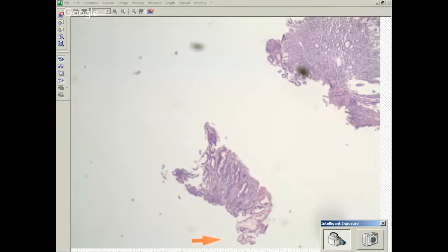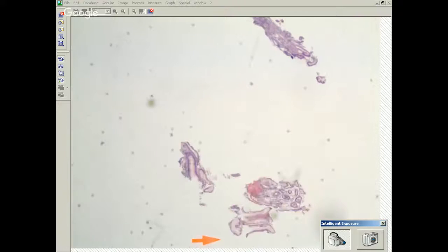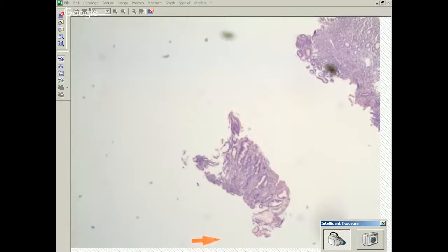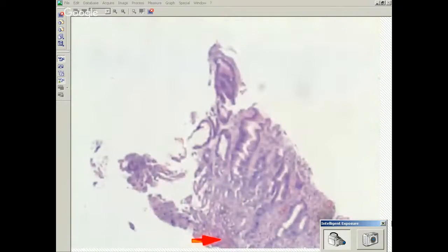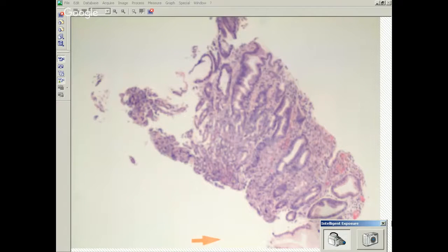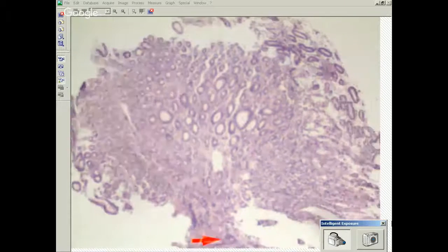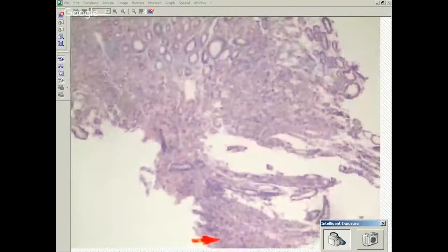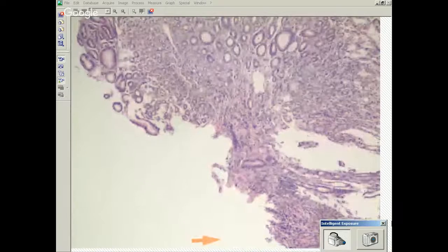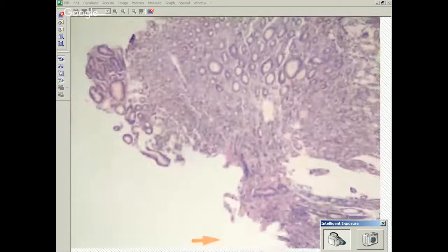Was he tested for HIV? That's a good question, right? What are you thinking? I mean, that's definitely pathognomonic for an HIV patient. Esophageal candidiasis, right? So he's quite immune compromised. So now you know he's immune compromised. Maybe he has HIV, and he has this sort of finding in his stomach, and the endoscopist tells you that they biopsied a lesion.